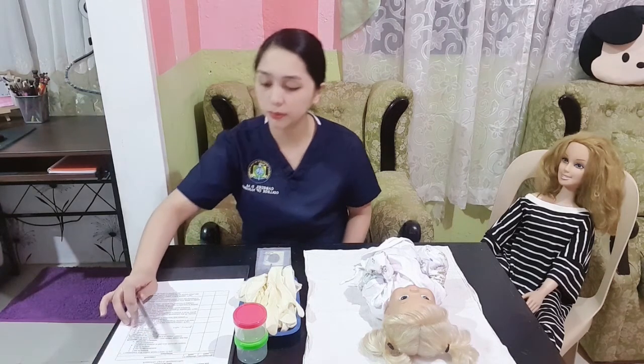So to start, first is to gather the equipment that I will be needing. Here I have prepared my urine bag, clean gloves, sample container, and I have also prepared the soap and water on the wash area. Next is to check the doctor's order. The order sheet is the most reliable source and legal record of the patient.